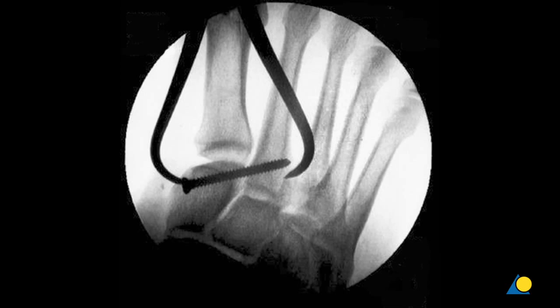It is important to note that the thread hole will be drilled using a 2.5 mm drill bit through the 2.9 mm sleeve, and that the bone is very soft — not really hard cortical bone, but rather soft cancellous bone, more like a shell with a soft interior. Since the thread hole is smaller than the core diameter of the screw, the screw will radially push the cancellous bone outward. This differs from standard AO technique in which the thread hole is drilled to the core diameter of the screw. The screw is inserted a little plantar and aimed a little superior.